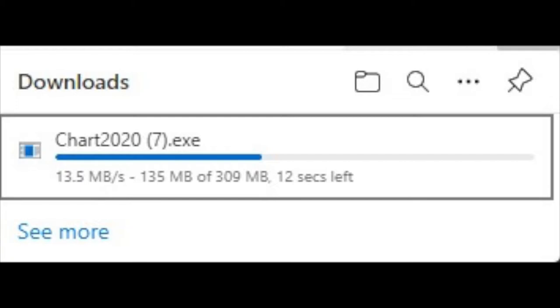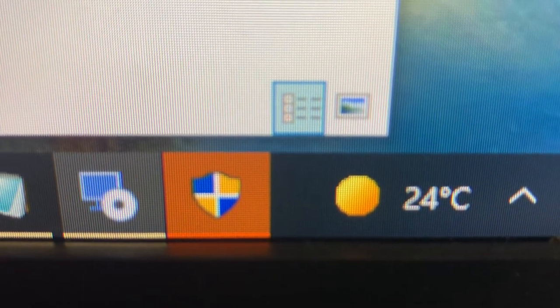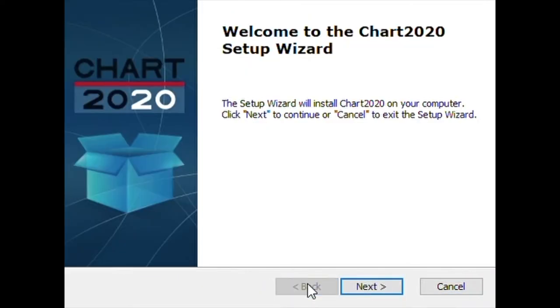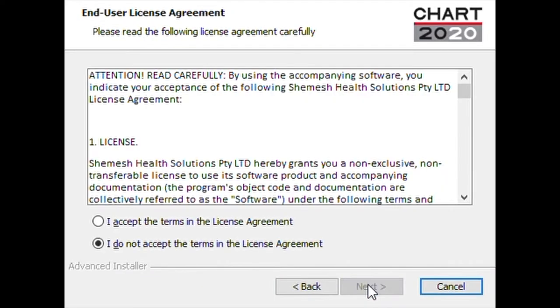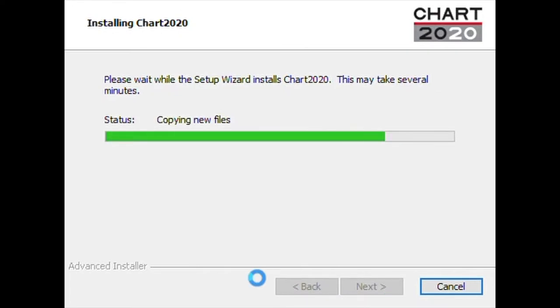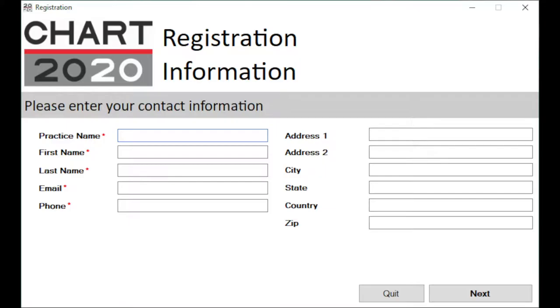Once you have downloaded the software, you need to run the installation file you have just downloaded. You will be prompted by Windows to allow installation by a flashing icon on the taskbar. Click on this icon and continue the installation process.